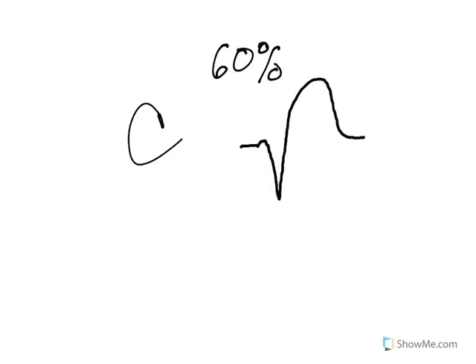Abnormal discordance. And that means that if the J point up here, and let's say this is probably the J point right there, if the J point is greater than 20% higher, right, or 20% the size of the QRS itself.